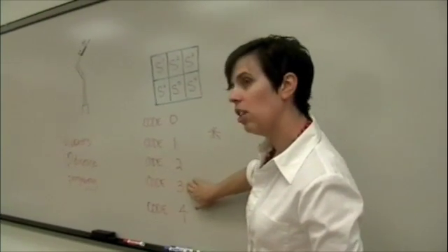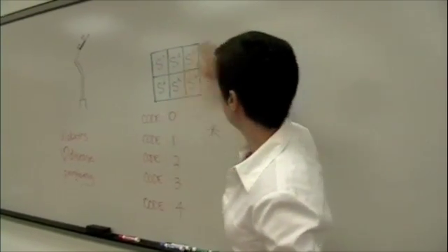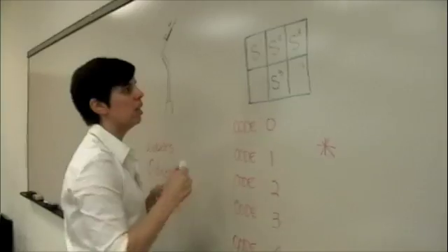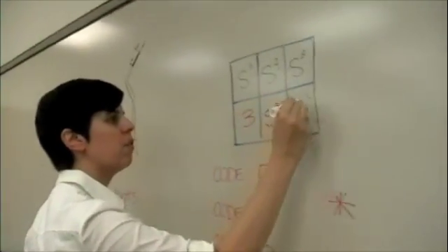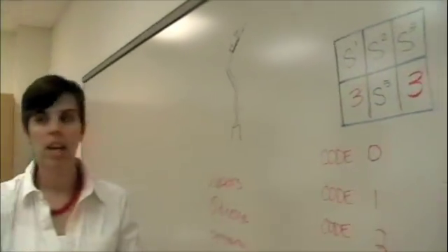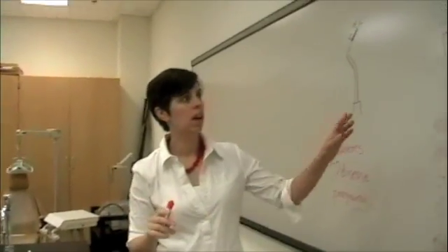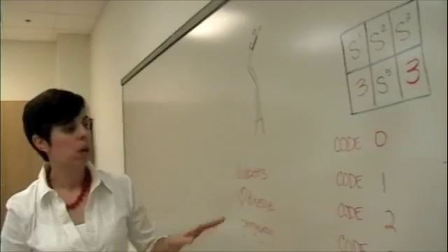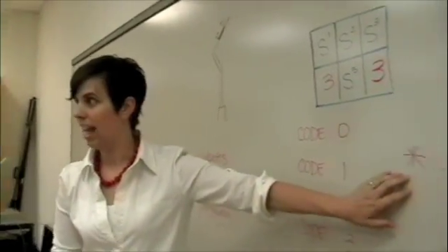If you get a combination of 2 code 3s, say you get code 3s in sextant 4 and sextant 6. If you get a combination of 2 code 3s anywhere in any of the sextants, you have to probe the entire mouth and record. So let's talk a little bit about the asterisk.